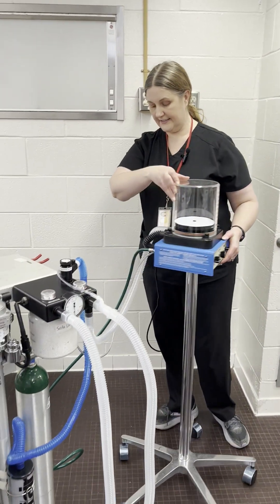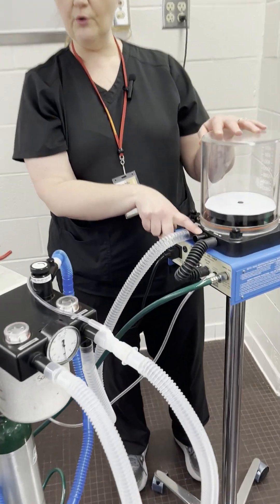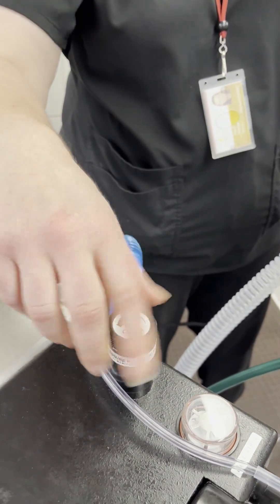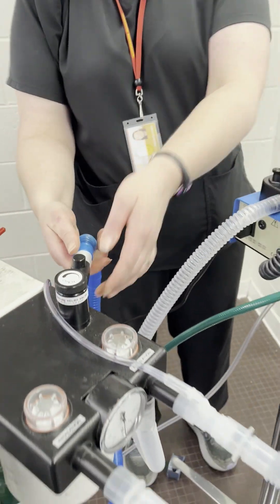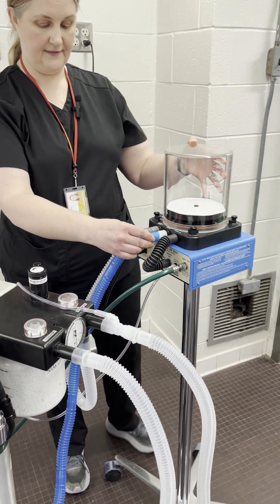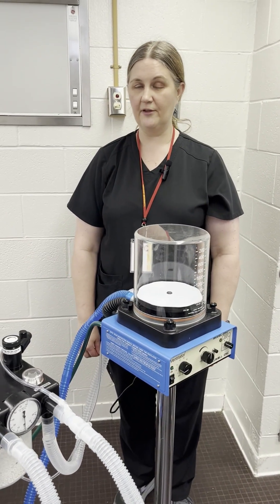Now the Hallowell has its own pop-off valve and exhaust off the back. So in order for it to function appropriately, we shut the pop-off valve on the anesthesia machine. Then we can remove the scavenge hose and attach it to the back of the Hallowell. And that's it — that's all the steps to set up the Hallowell.